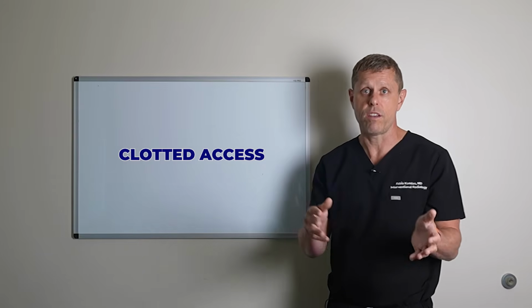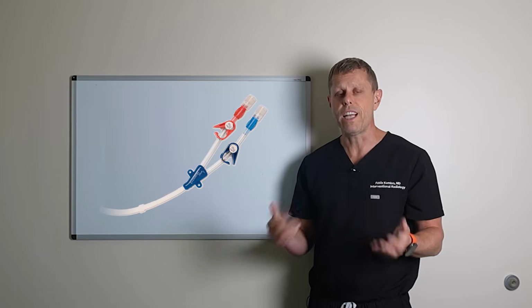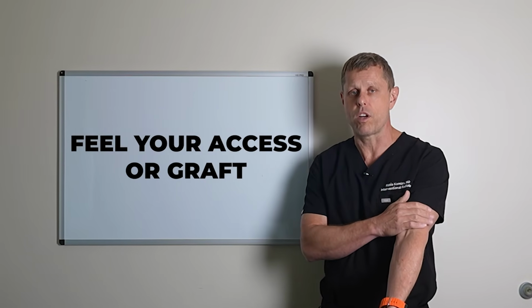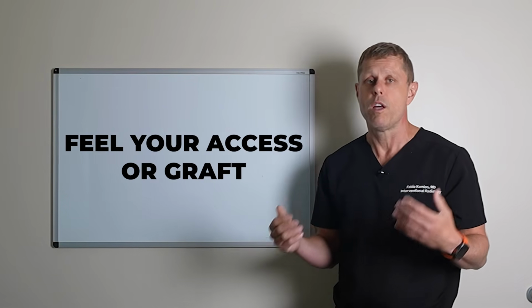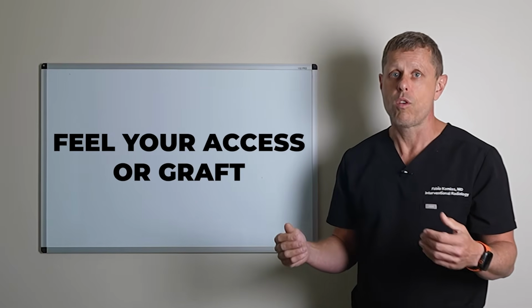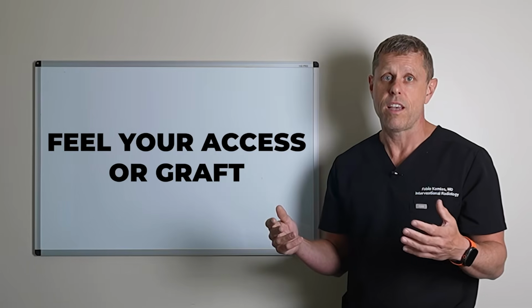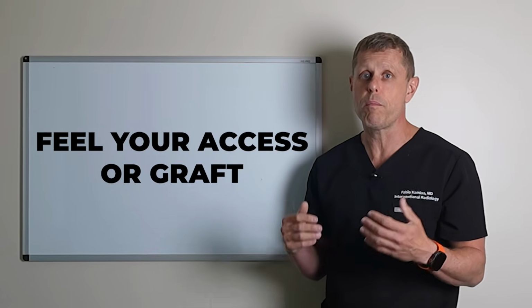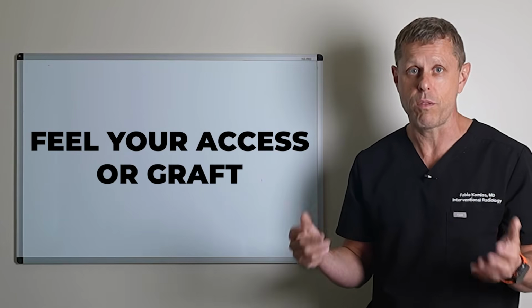You have to see an interventional radiologist. So that's why it's important to learn how to feel your access or graft. So I recommend people feeling their graft and checking almost every day, because then they can realize that the graft is clotted or there is a problem even before they see an interventional radiologist.